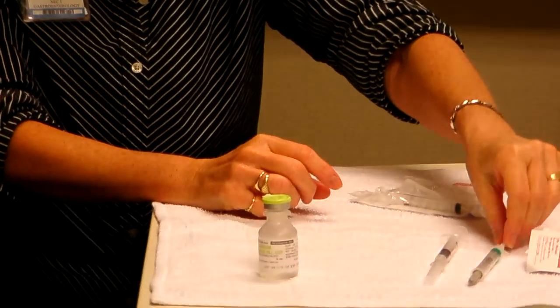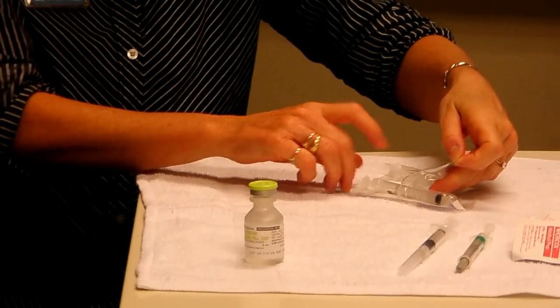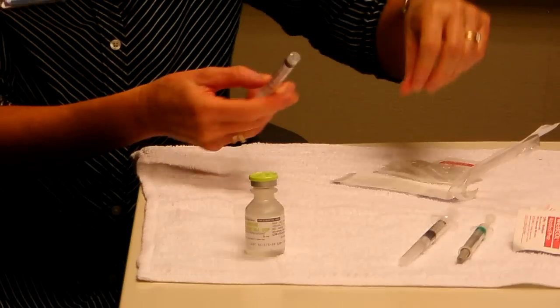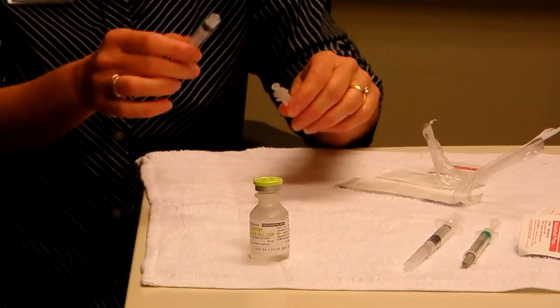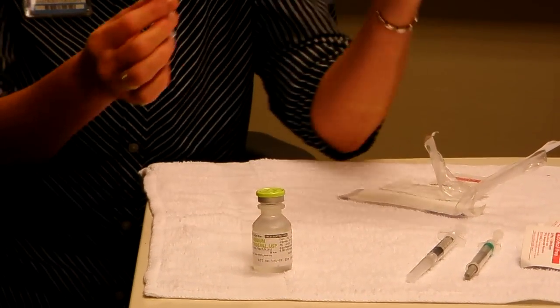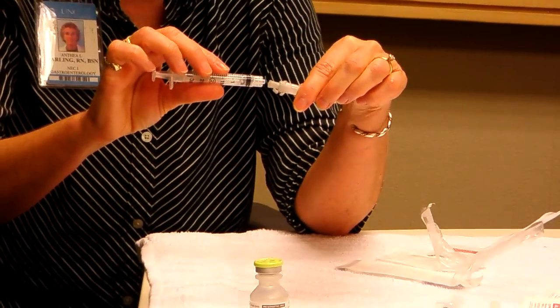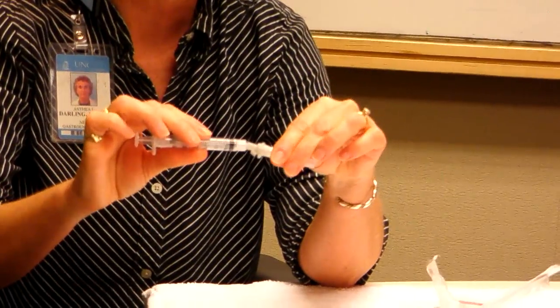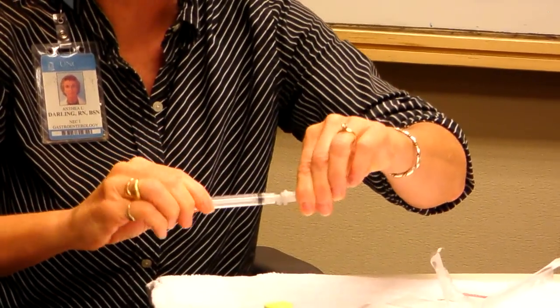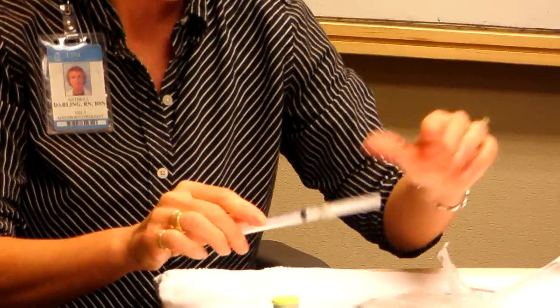I'm going to use a 3 milliliter syringe with a small gauge needle, depending on which of the needle sizes your doctor has given you. Makes no difference, just ask your doctor which one is easiest. Some of the needle and syringes do not come attached together. You may have to do that. It's easy enough to do. Screw top, just twist it on until it's tight, and there's your needle and your syringe combination.